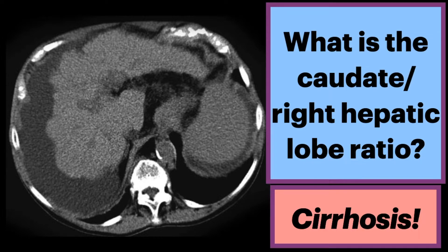On this non-contrast CT, we see very advanced cirrhotic disease with a small nodular liver. There's hypertrophy of the caudate lobe as well as extensive ascites.